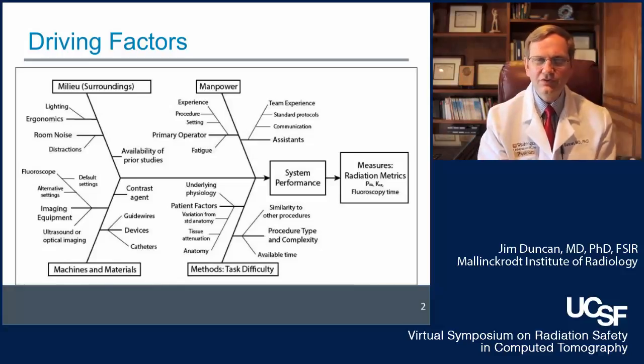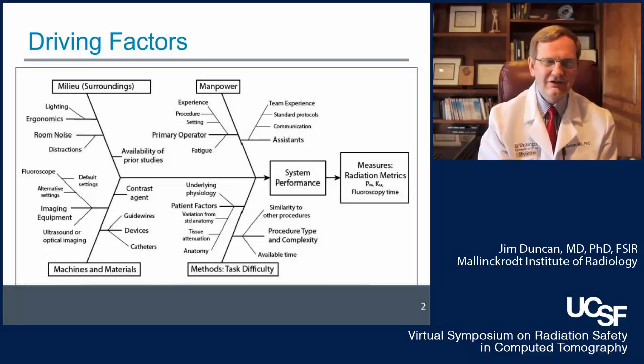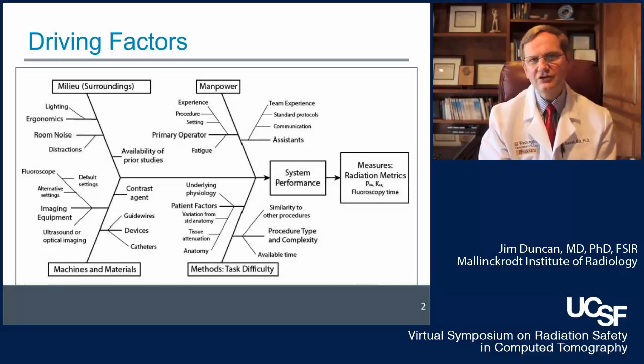The milieu, the environment that you're working in. Are the monitors well lit? Are you working in an environment that's conducive to doing these procedures? And what about distractions and availability of prior studies? Prior studies we'll emphasize a little bit later in the presentation.